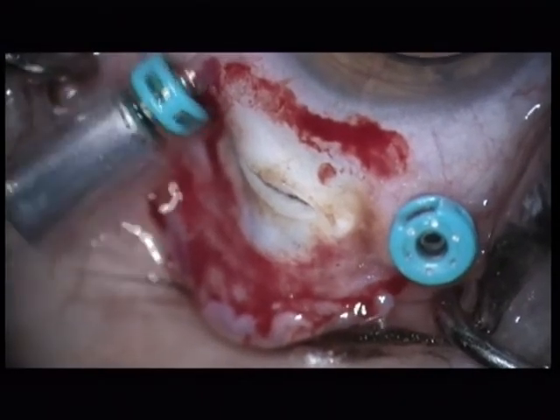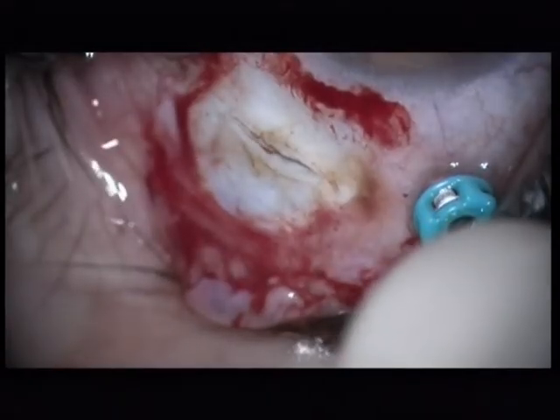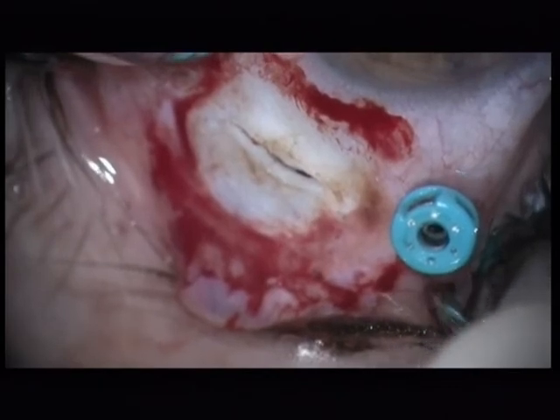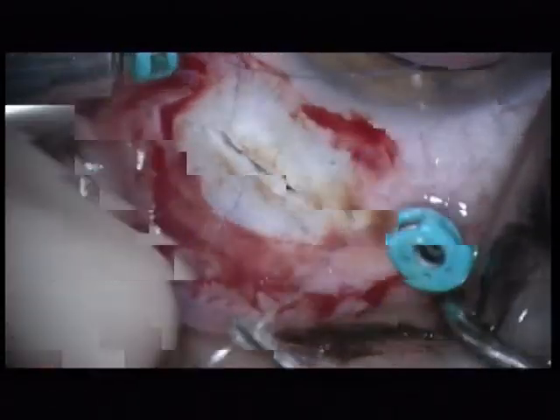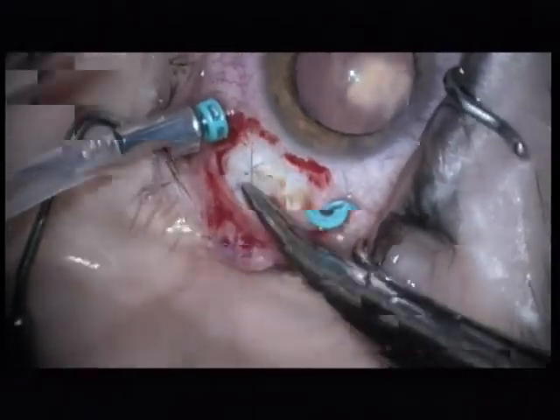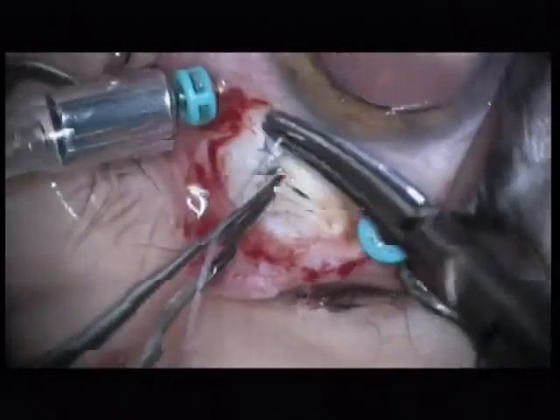Now we can close the sclerotomy. I am using Vicryl 8-0 cross sutures to close this sclerotomy.